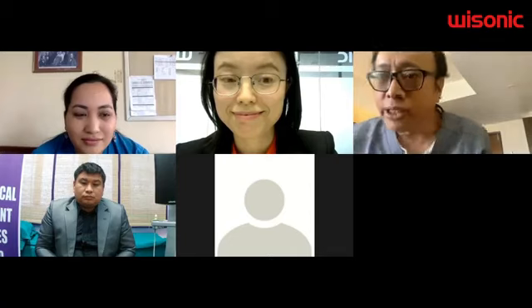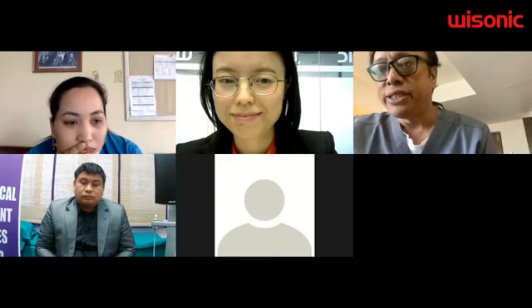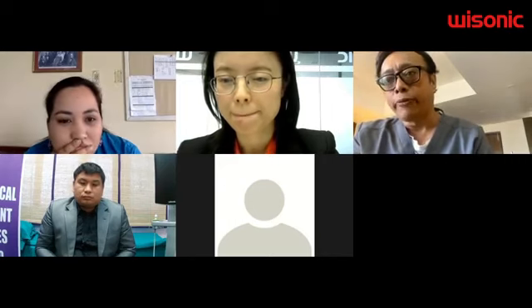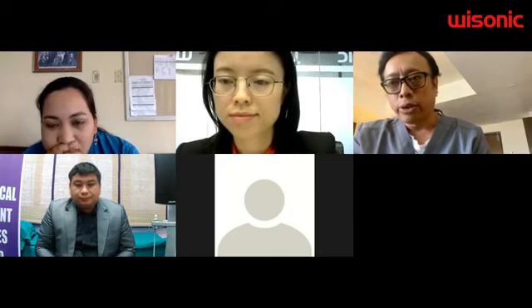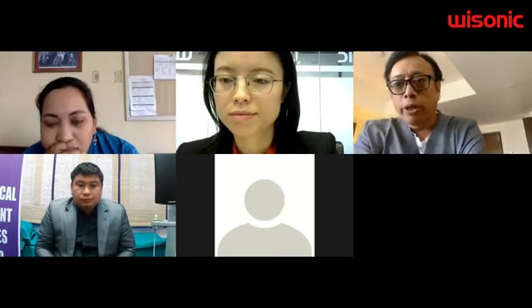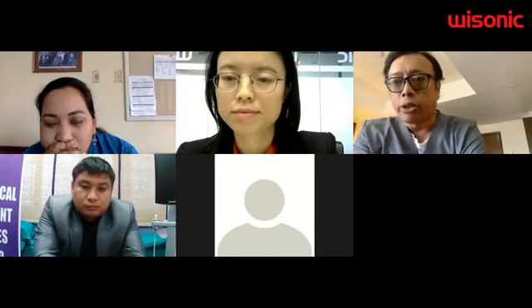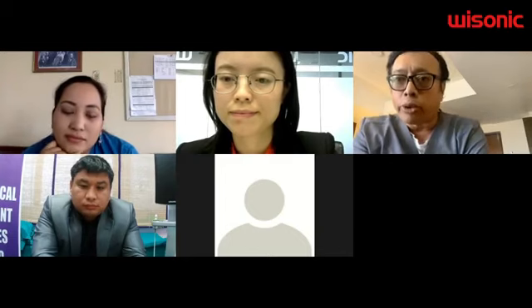Can I add something to this answer? Hydrodistension is a very useful tool, especially in adhesive capsulitis. But I think it will be better for a young pain physician to go for a suprascapular nerve block before hydrodilatation or distension, because it can produce lots of pain. So what I usually do is combine a suprascapular nerve block followed by hydrodistension, with all precautions taken, like giving small aliquots of drug.